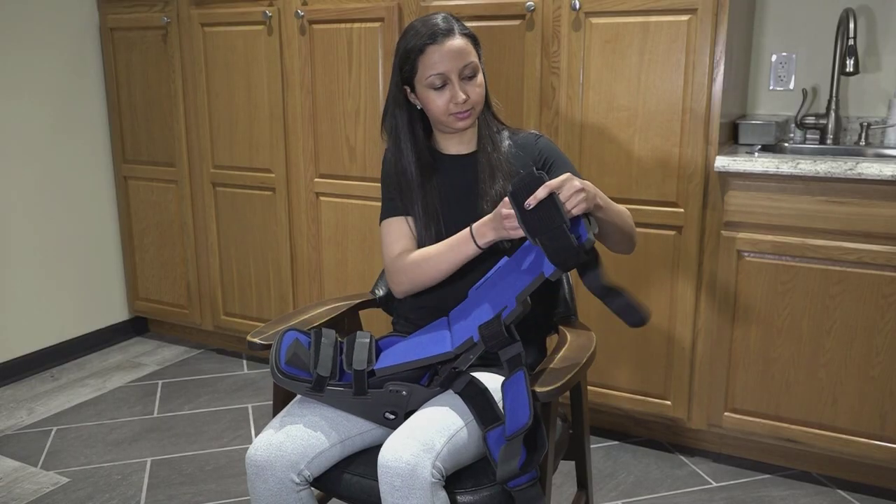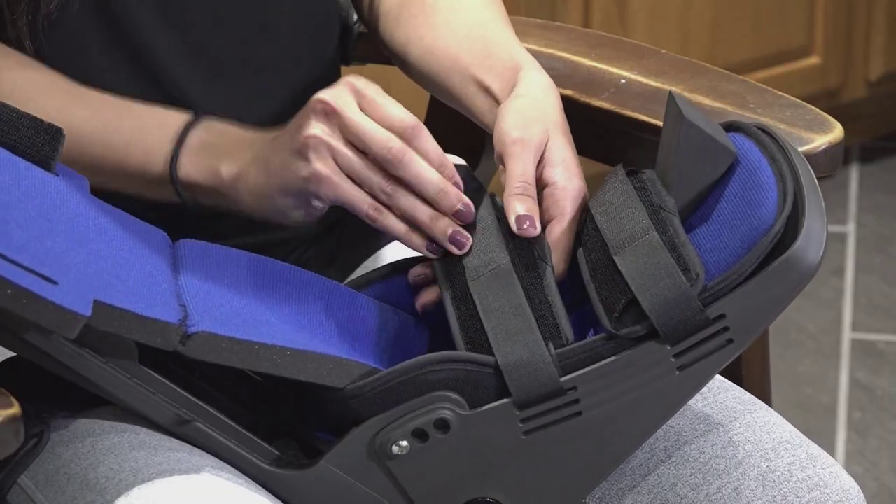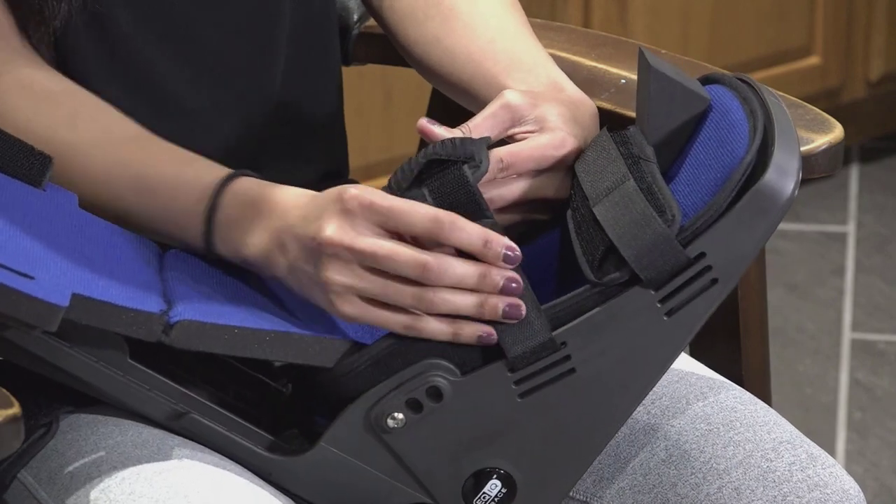First, release the ankle and leg straps. Be sure to reattach the Velcro to the straps. Next, loosen the foot straps but keep them threaded.